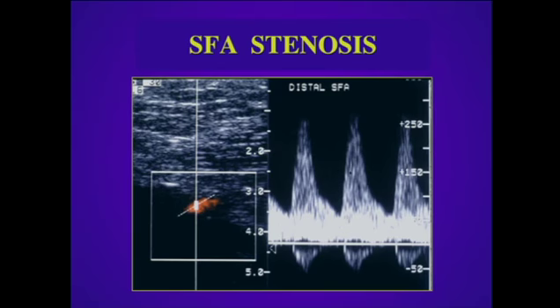and diastole. Notice again we have this diamond-shaped artifact that occurs during peak systole, and we see it both above and below the baseline in peak systole, and this represents a bruit on pulse Doppler examination.